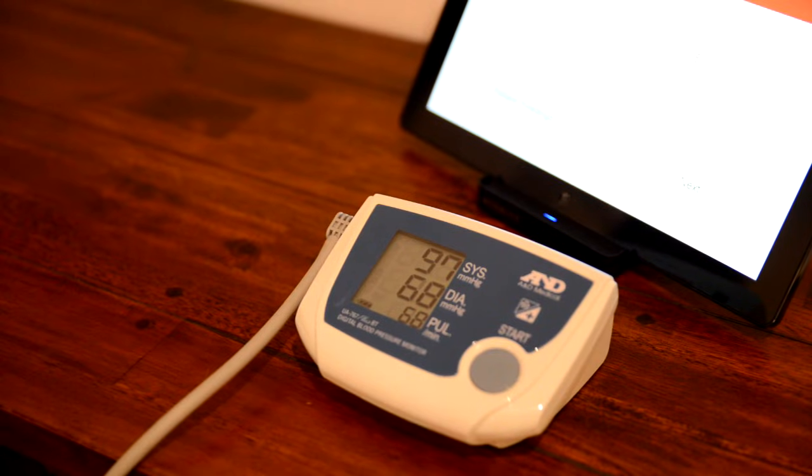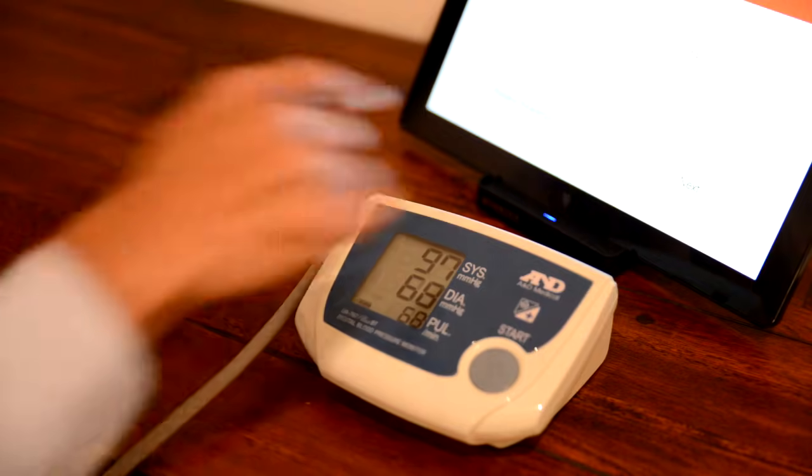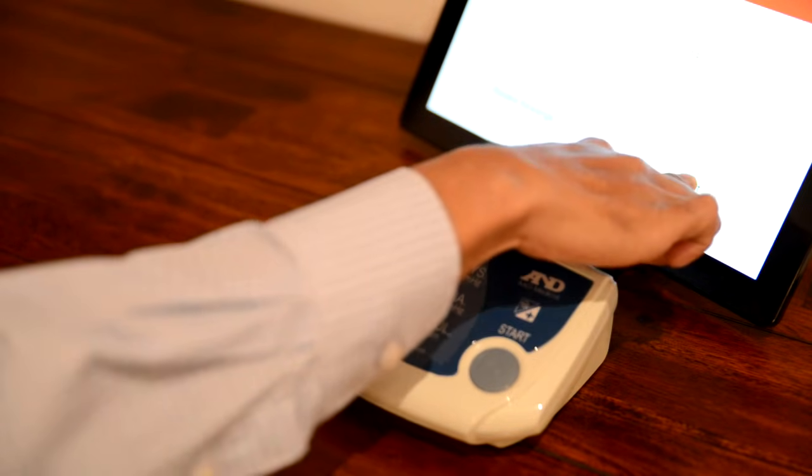Once the measurement is announced from the Telehealth Hub, remove the cuff and press next on the Telehealth Hub to continue.